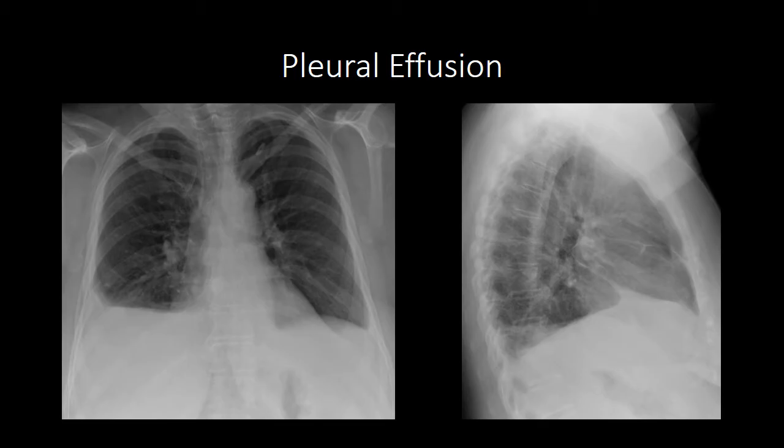We have a frontal and a lateral chest radiograph. In this patient, we can see some of the classic signs of pleural effusion. This is an upright radiograph, and in this case we can see a meniscus formed by the fluid resting in the lower part of this person's right hemithorax. That fluid is causing a little bit of thickening or separation between the ribs and the lung tissue, and it's also causing some underlying atelectasis, which is not easily separable on a radiograph from the pleural effusion.